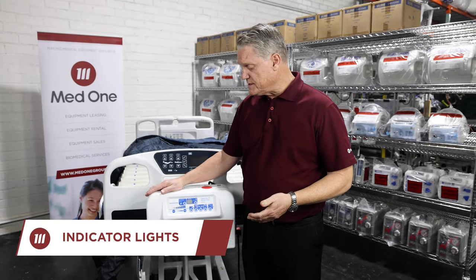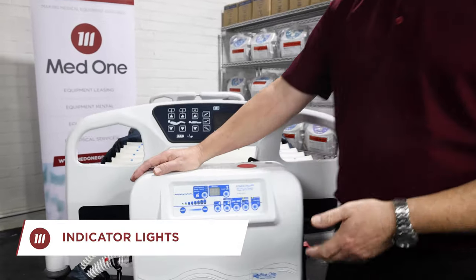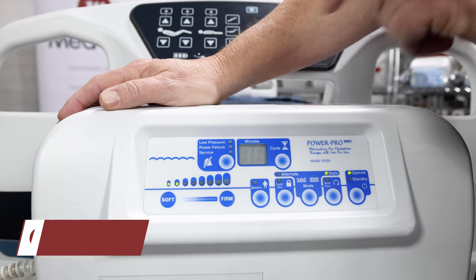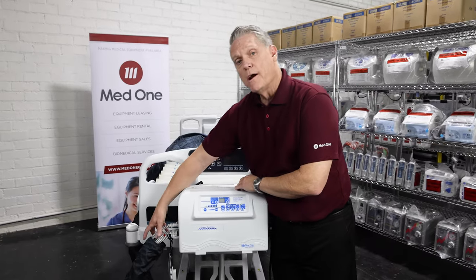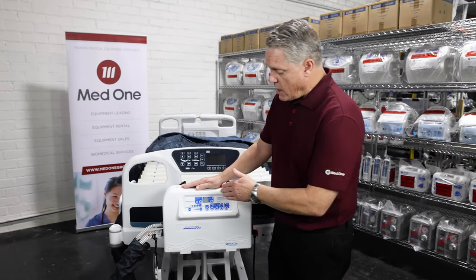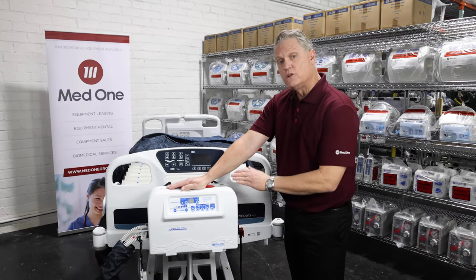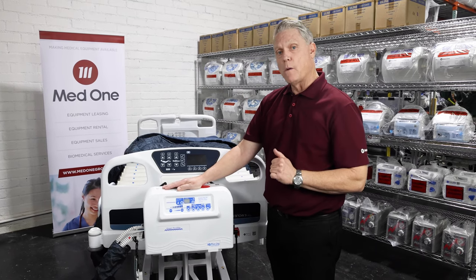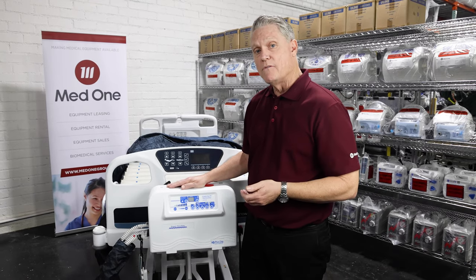Above the soft and firm keys is our service indicator section. Under the service indicator section, there are three categories: low pressure, power failure, and service light. Under a low pressure alarm, you'll always want to check your air hoses on the control unit to make sure they're properly connected. Under the power failure indicator, you'll want to check your electrical cord going from the control unit to the wall to ensure you're properly connected for power. If you do receive a service light, you'll need to call your MedOne office for repair.